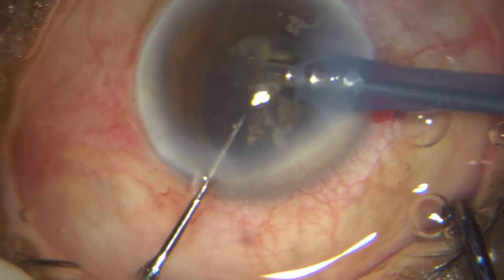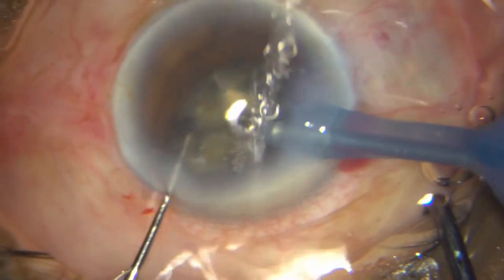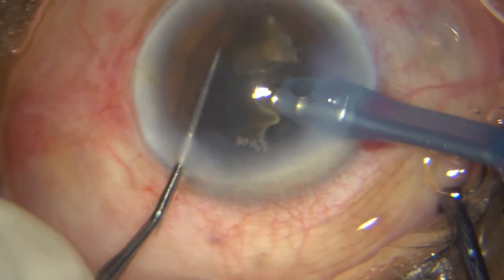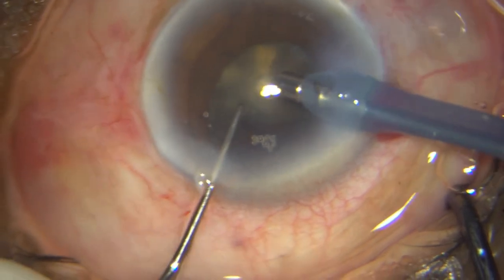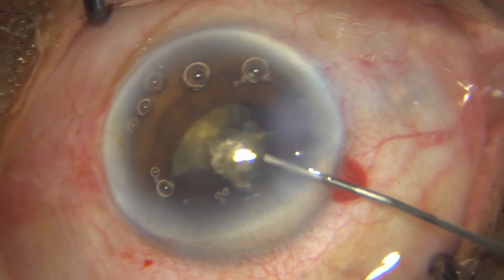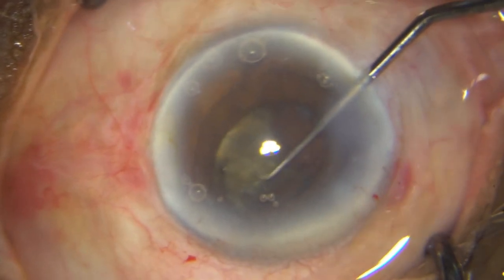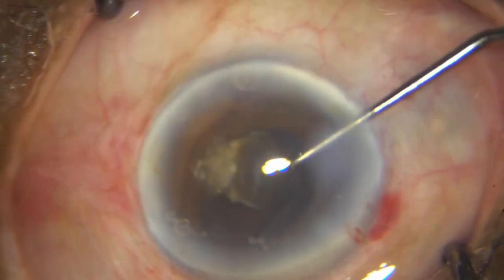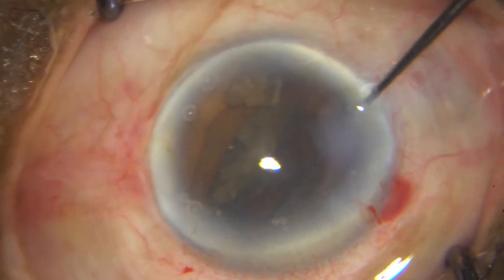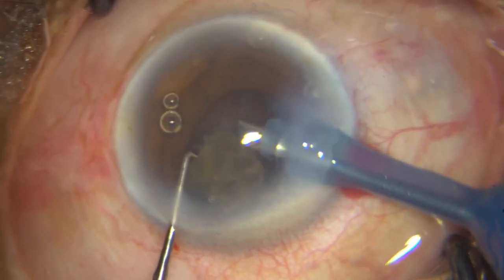Now I can see this attachment — it is a little tricky. I am going to take out this part, but there will be an attachment which I have to mechanically lever upwards. So I have taken out this piece. It is not worth trying to take this out now — just put in some high molecular weight viscoelastic and use your dialer. I am trying to get that attachment. I just prolapse this little bit of piece out and rotate it to see the attachment. Just tilt the attachment upwards — once you get this attachment, things are going to be very easy. Don't catch the pupil. Once that is done, everything will just come in like butter. That is it, it is over.